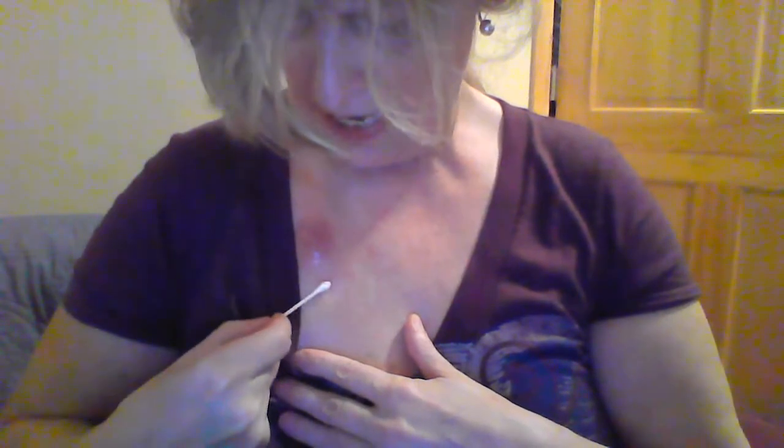So I made a decision not to access the port. The doctor thought it was okay to go ahead and continue my IVs and come home and be accessed, but I made a decision not to do that and just let the medicine do its work, because this is exceptionally tender. It's just a little alcohol wipe. But I'm just going around the outside, never touching the top. And there it's draining more.